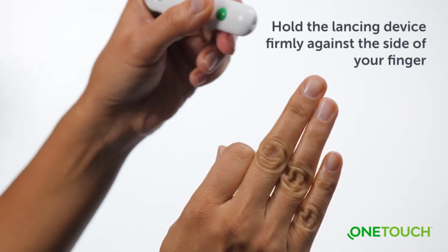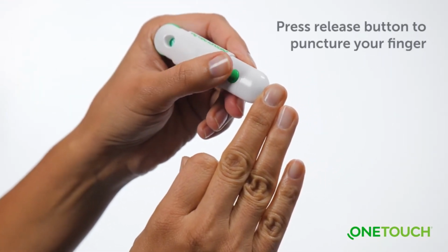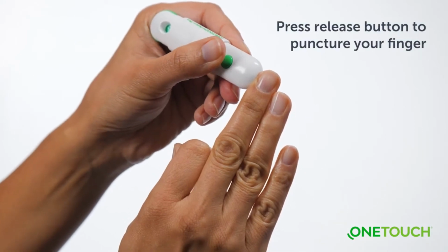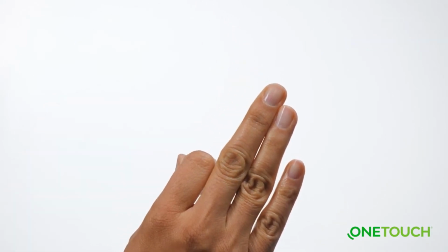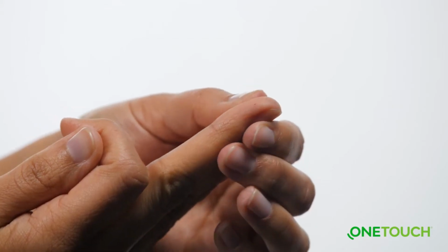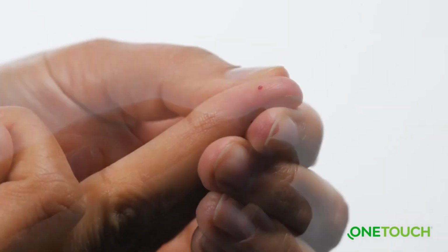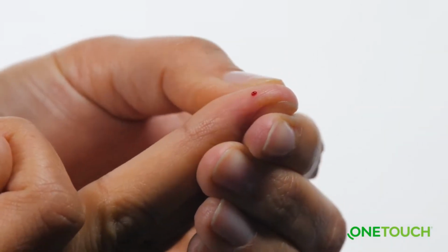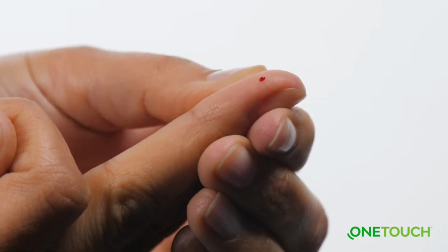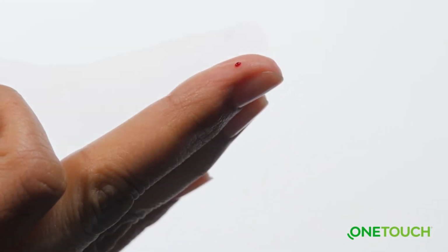Hold the OneTouch Delica Plus lancing device firmly against the side of your finger. When you're ready, press the release button to puncture your finger. Remove the lancing device from your finger. Then, gently squeeze and/or massage your finger until a round droplet of blood forms, like this. If the blood smears or runs, do not use that sample. Dry the area and gently squeeze another drop of blood or puncture a new site.